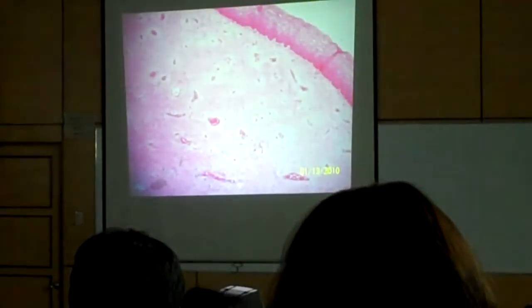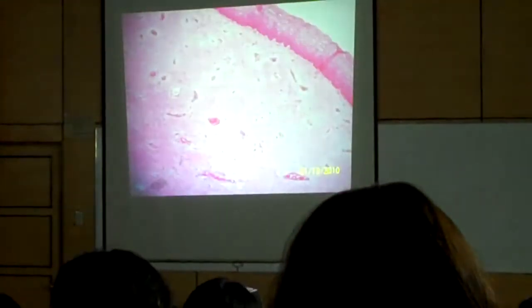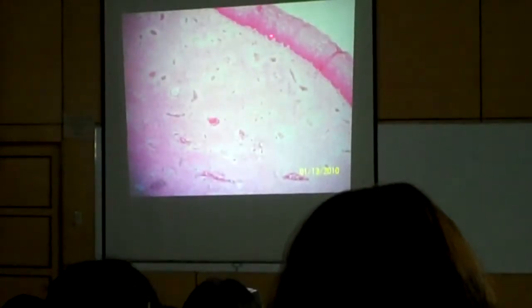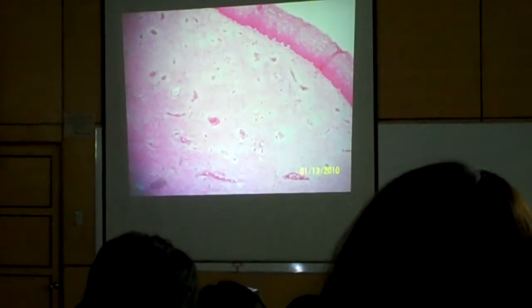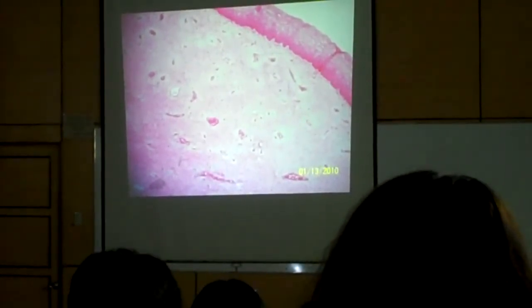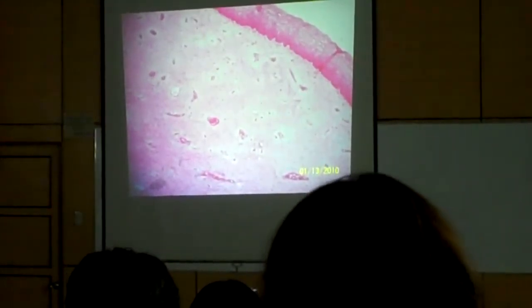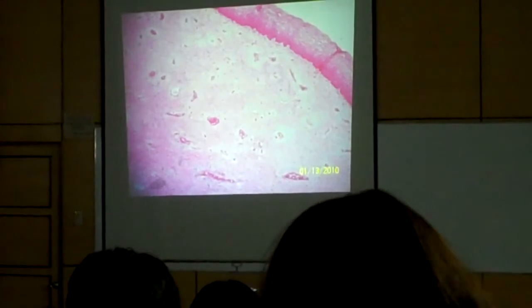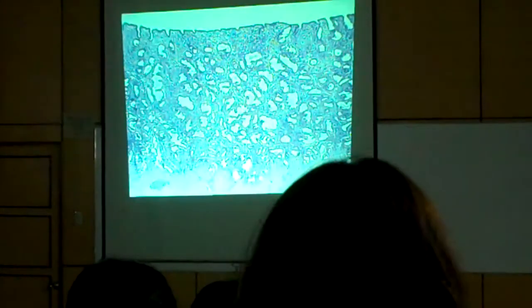Okay, it's blurred, but it's also the cervix, on the endocervical side or area, and this is on the ectocervical area. Okay, but then again, we will show you as much as possible the entire cervix, if it is possible. If not, then it's just focused on where the squamocolumnar junction is.